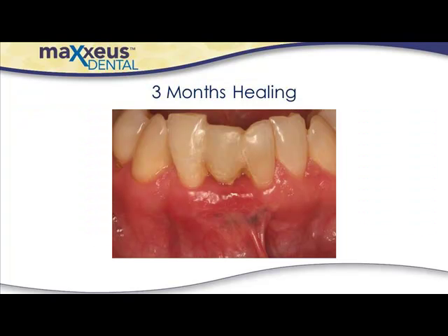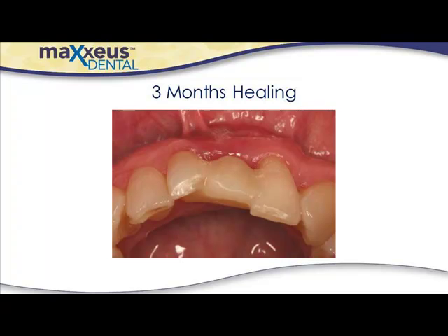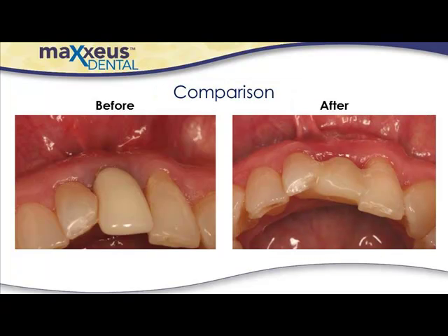Shown is the facial view of healing at 3 months. Note the improved bony architecture and gingival contours at the surgical site. In the occlusal view of healing at 3 months, note the wide reconstructed ridge at the surgical site. Here is a before and after comparison at 3 months.